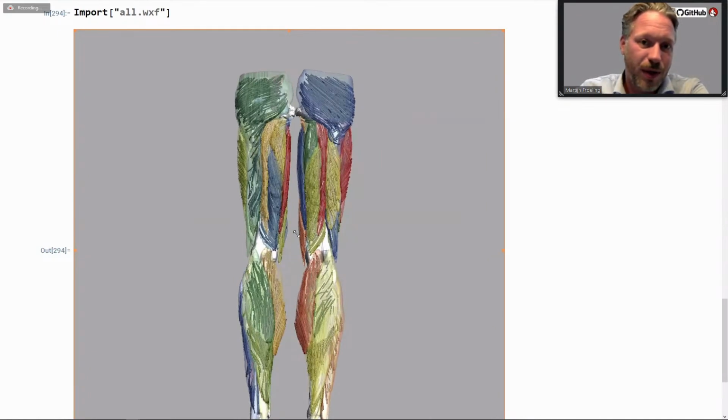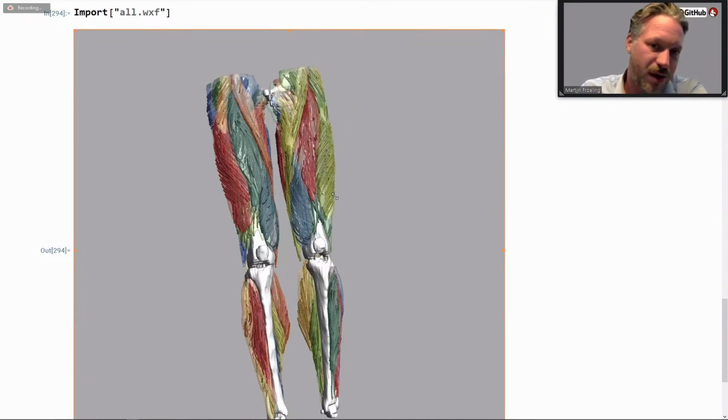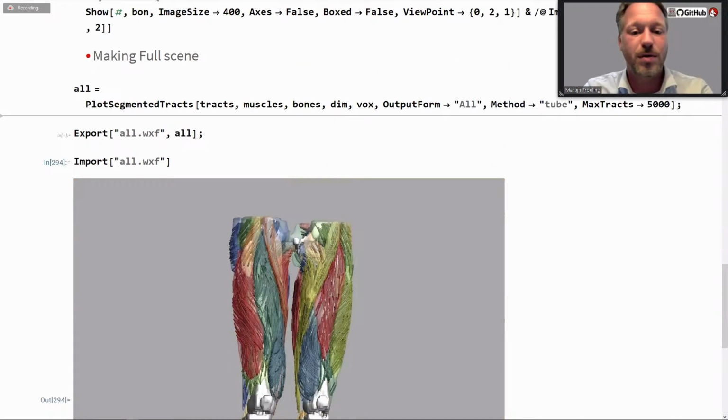My chat window that I was trying to see the questions in froze a bit during the presentation, so I think I missed a few questions along the way. I think for the gradient optimization, it's electrostatic repulsion, the spatial resolution indeed of the data set I showed.